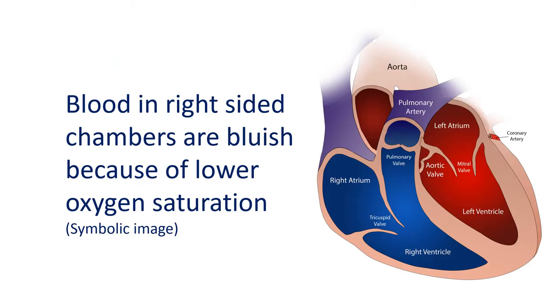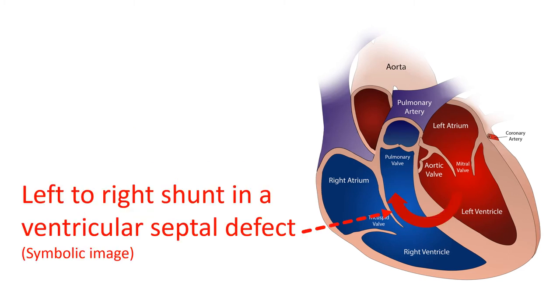Oxygen saturation is measured by withdrawing small samples of blood from the concerned chamber. The samples are analyzed in an equipment known as blood gas analyzer, which gives the amount of oxygen in blood as well as other important information. Usually, oxygen levels are lower in the right-sided chambers and pulmonary artery and higher in the left-sided chambers and aorta. But this can change in birth defects of the heart when the origin of the blood vessels and position of the heart chambers can be abnormal.